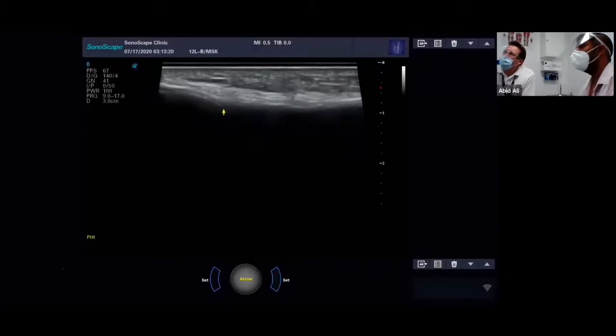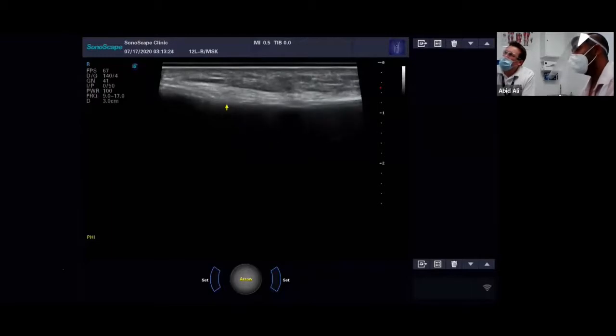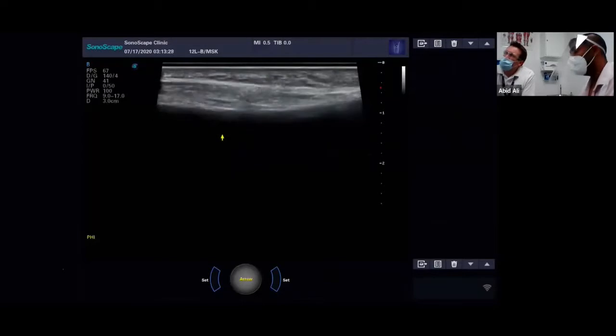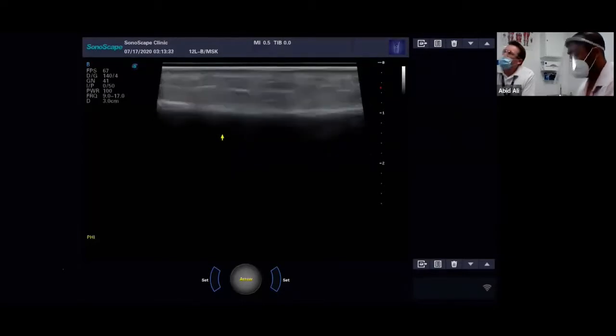See how it's going fuzzy there. I've lost the contact. I've only tilted my probe very slightly, but we've lost that nice bright white line. So small fine-tuning movements here are required. Okay, let's carry on moving downwards.